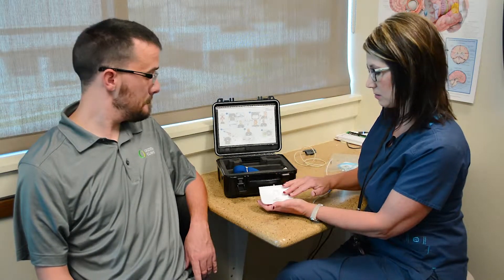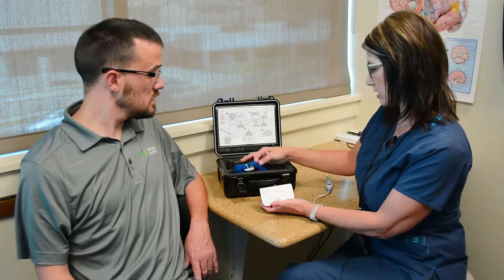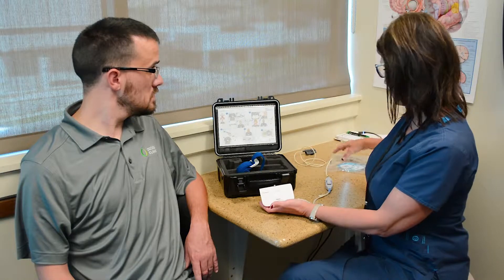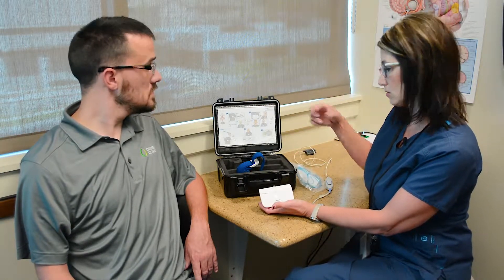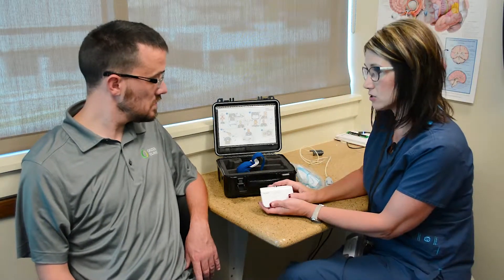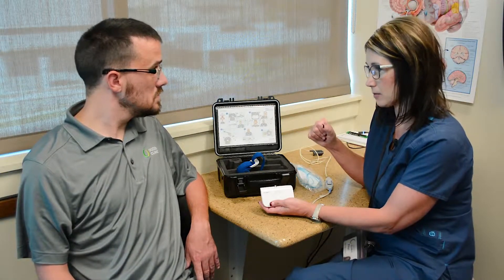This is the main piece that's going to sit right here on your diaphragm. The next part is going to be the belt that's going to monitor the air that comes in and out of your diaphragm. We have the cannula that's going to be going in your nose, and also the oximeter that's going to be going on your finger. Batteries are charged and ready to go — they are good for both nights, so you don't have to worry about the batteries.